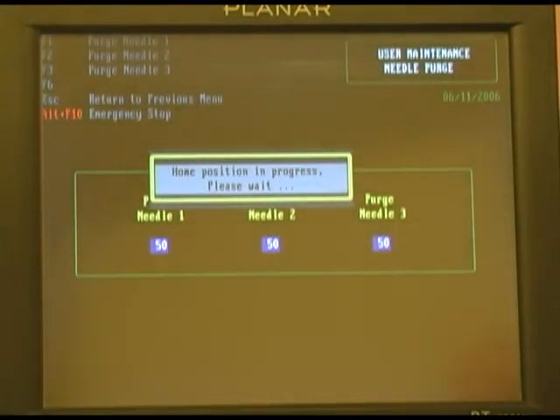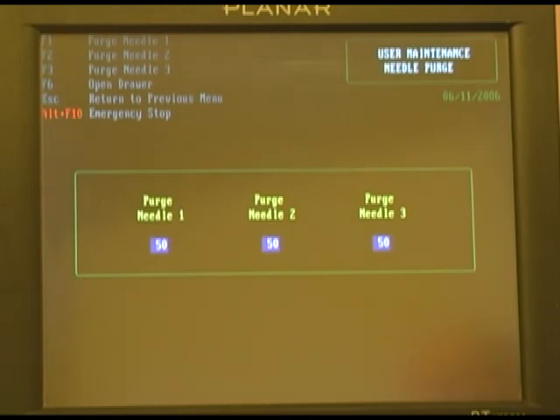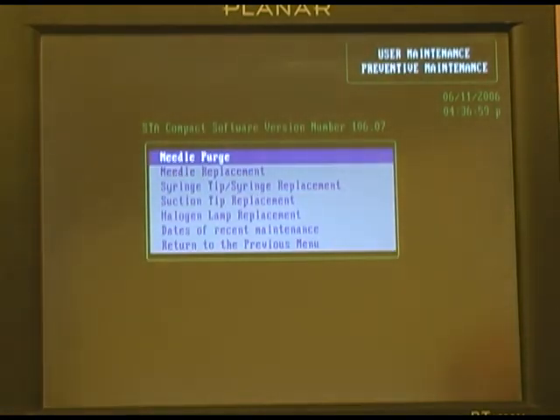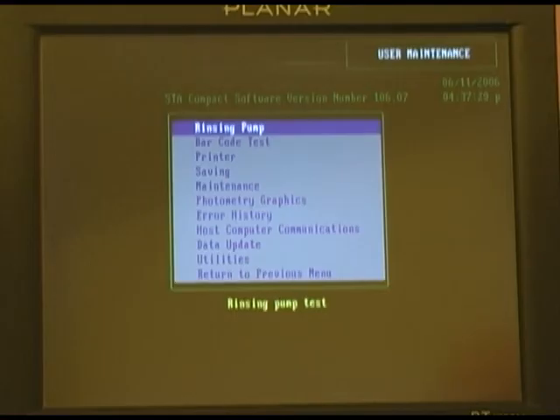The instrument also gives you the capability of using this feature to rinse the needles. This may become necessary if you are doing a heavy bleaching on the unit, or if you want to verify whether or not a needle has a possible clog. This will allow you to remove the clog and or witness the dispersion of the needle flow out of the needles to check the needles for proper operation. And that concludes the user maintenance portion of the software application.